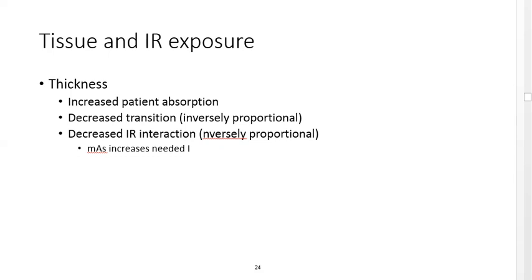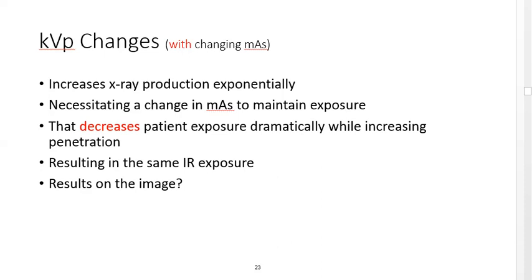And let me back up. You can play with this in clinicals on slow days. I would encourage you to take a number of different things and just make an X-ray of them. Not living tissue, but you can take a sharps container, a tennis shoe, a jug of barium, a jug of water, a water bottle, whatever, and put them all on an image receptor and shoot them all at the same time, and then adjust your kVp in both directions. Start off with maybe a technique of 60 kVp, increase to 70 kVp, shoot it, and compare the images.